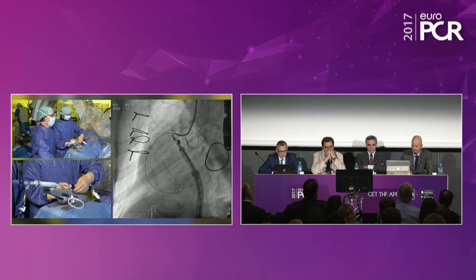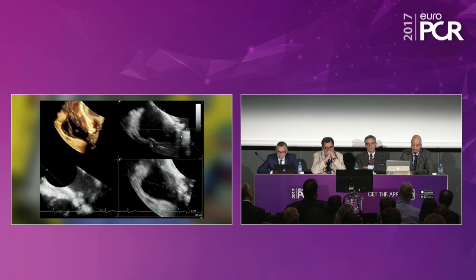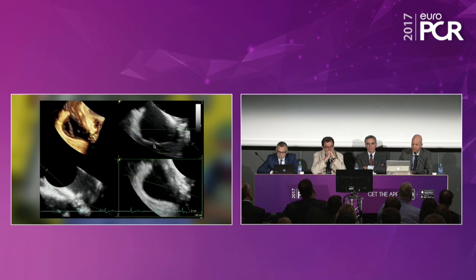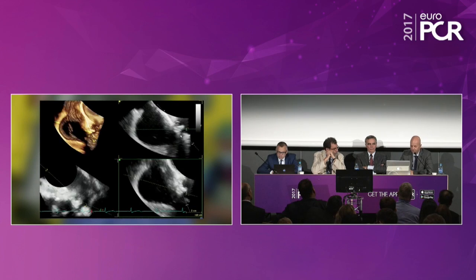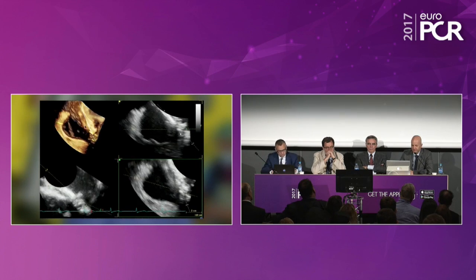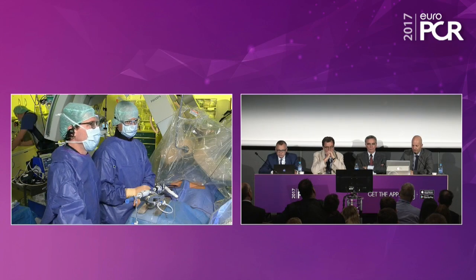We had some anchors sitting in the right coronary artery, also in our institution. Nothing happened. One patient had a perforation of the right coronary artery, but it was easy to fix. But you should take care and should prevent this. This is another flexi-slice cut, and then you have to move around.